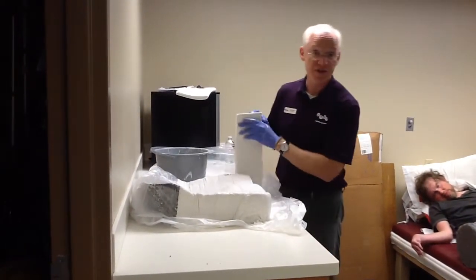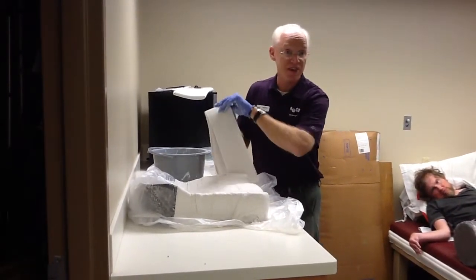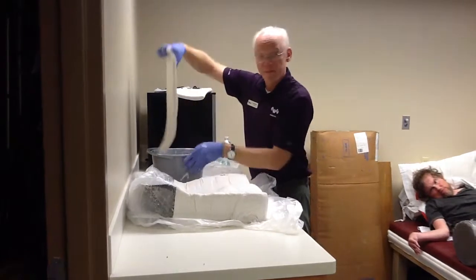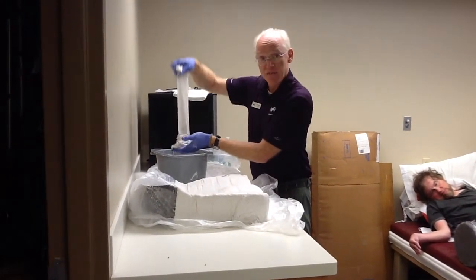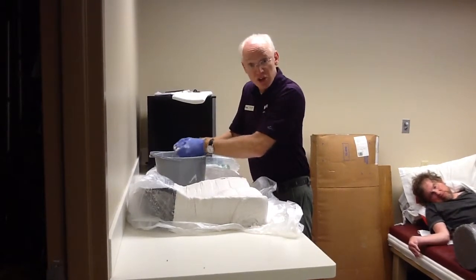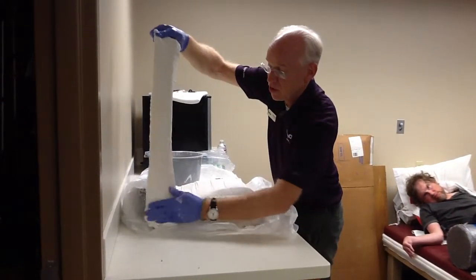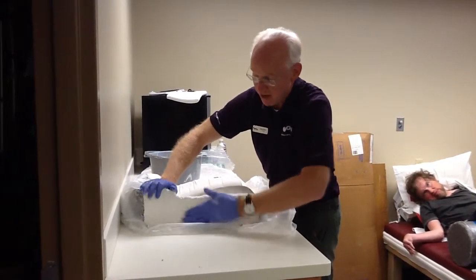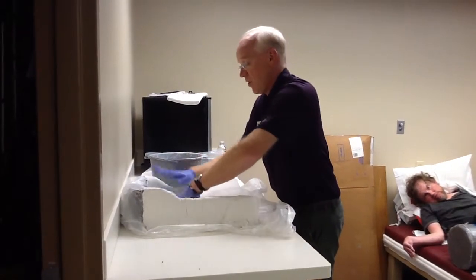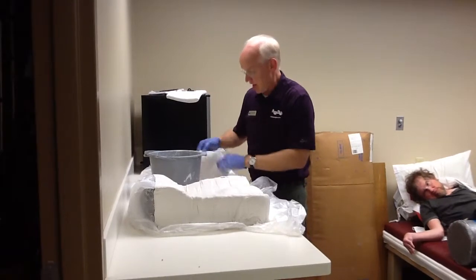Double check the loading. And again, if you've got safe offloading, good skin response, good position in the chair, good postural outcome — do what I'm doing right now. Wet plaster, rubbing it in really good, capturing the table.